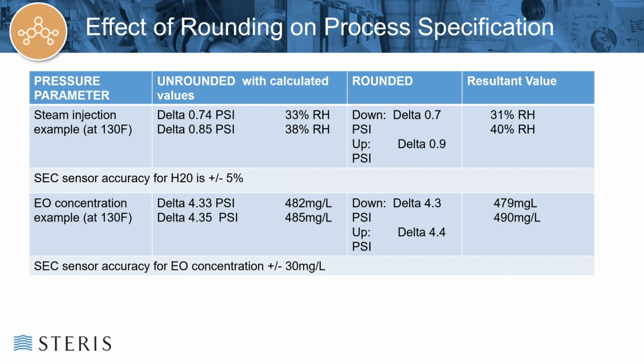So by adding that extra decimal in the hundredths place for PSI, you're creating a false sense of accuracy, and you don't need to do that when setting your limits. So keep it at the 0.1 level for PSI, and then the chart earlier gave recommendations for other units of measure such as inches of mercury, millibar, etc.